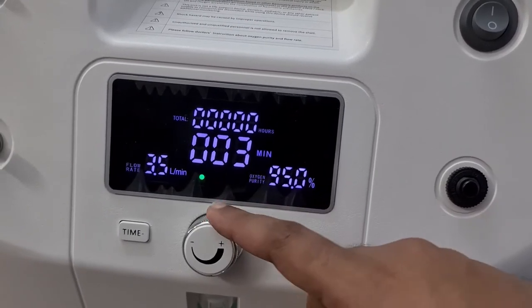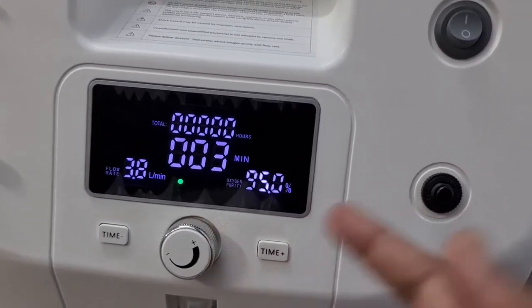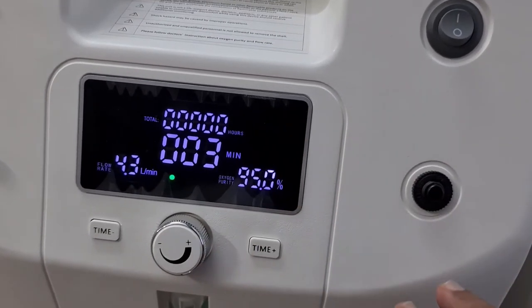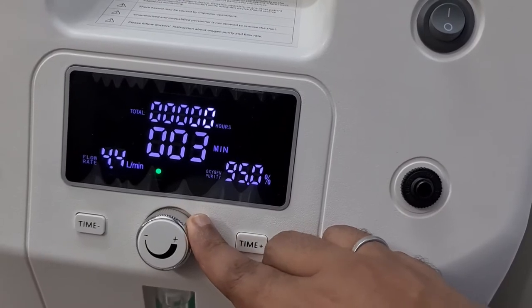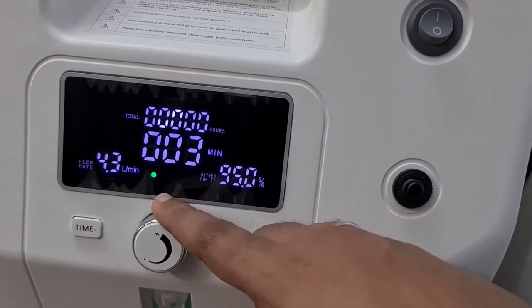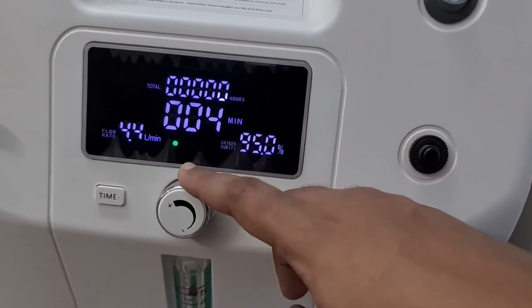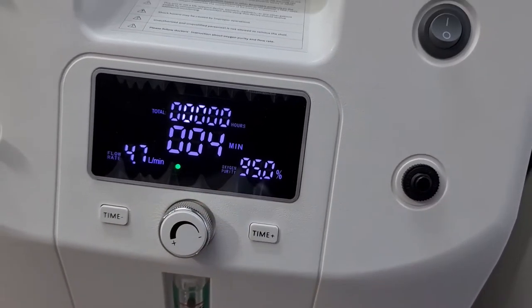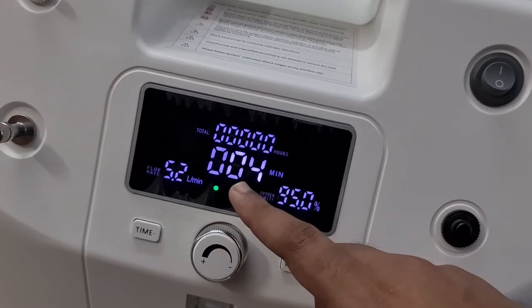If you are going to keep the output at 8 or 7, then adjust the flow rates accordingly — you can keep both machines at 4, or one at 5 and the other at 3. To take the output at 10, I would keep both machines at 5. Both machines are now at the desired flow rate.